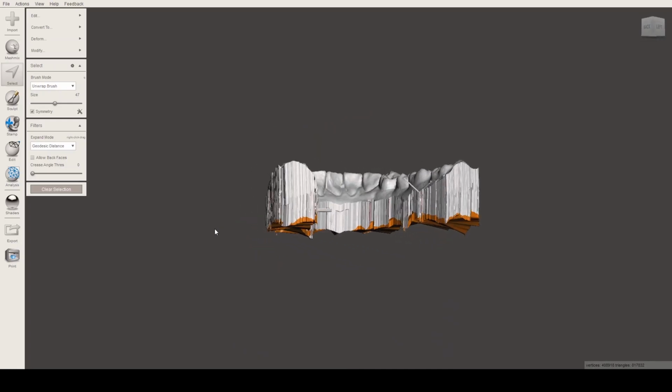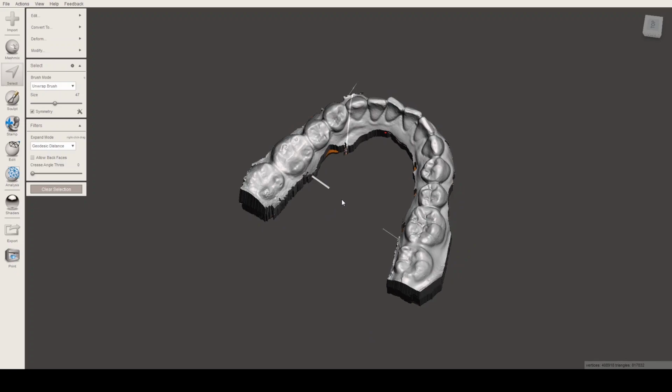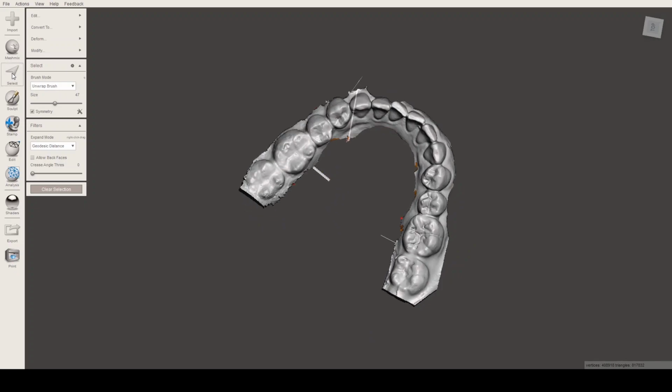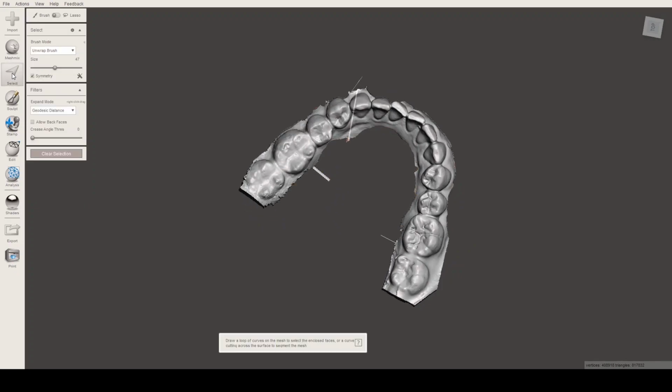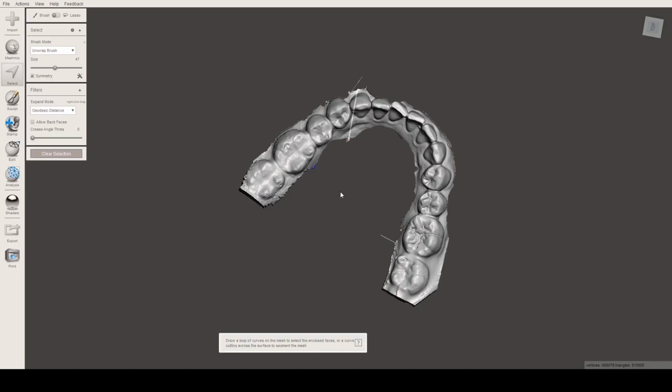Okay, it's not a clean extrusion. There are points that are actually, whew. Okay, we can actually work with that and delete that. So the way to delete, for perfect demonstration for deleting things in a model, just select it and then press X. That's it. That's the way to delete things.